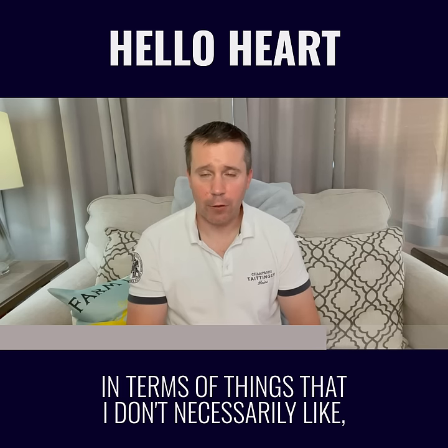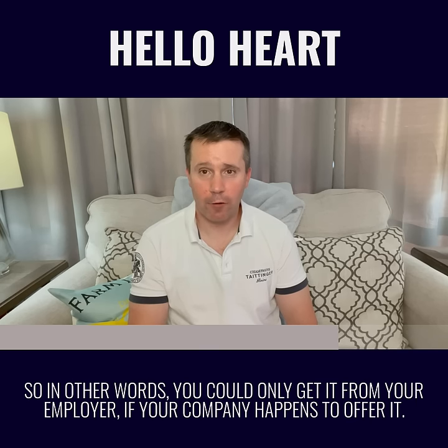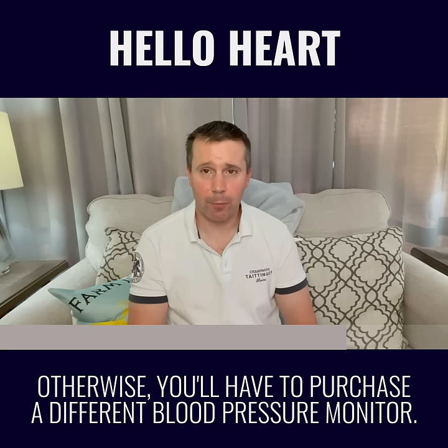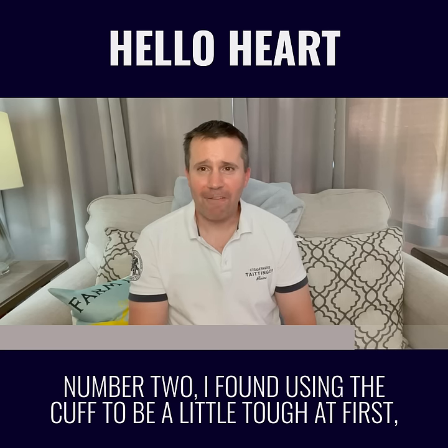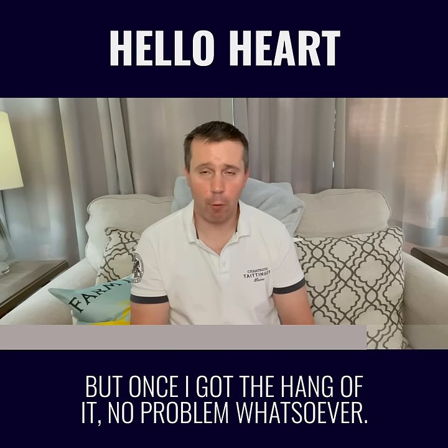In terms of things that I don't necessarily like: the HelloHeart isn't available in the individual market, so you can only get it from your employer if your company happens to offer it — otherwise, you'll have to purchase a different blood pressure monitor. Number two, I found using the cuff to be a little tough at first, and it took me a few tries to get that right, but once I got the hang of it, no problem whatsoever.